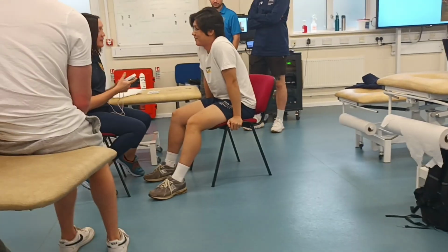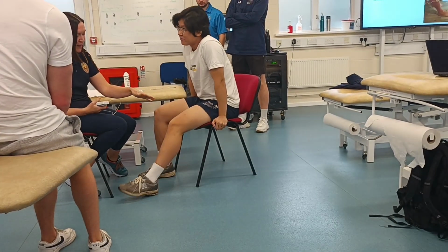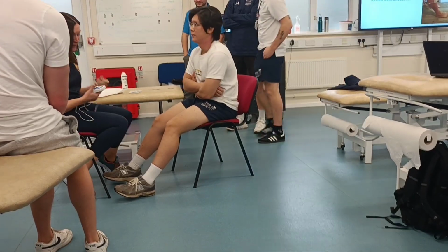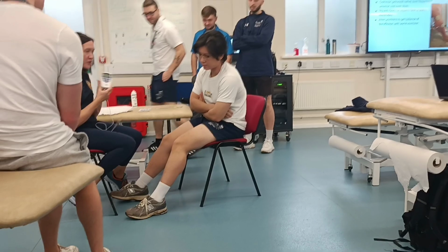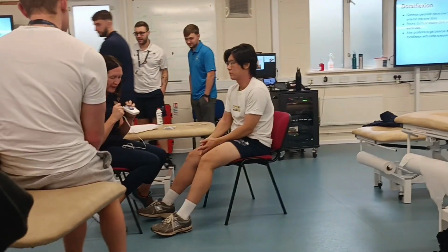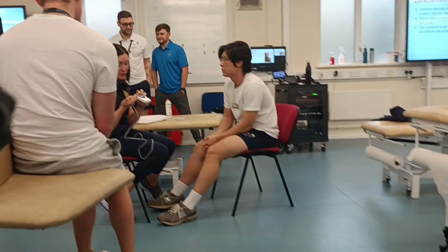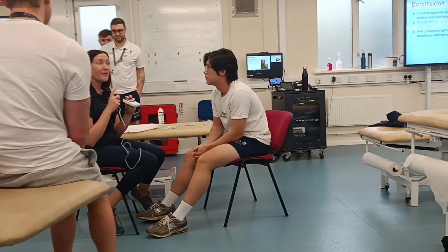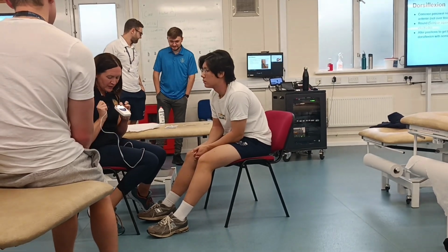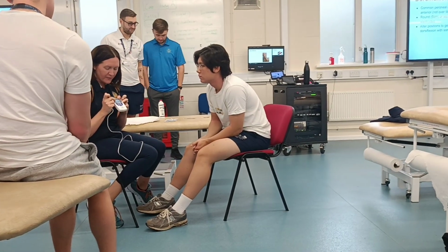Okay. So normally, if I was doing this with a patient, I would sit next to them, so you can see I shall come in front. Machines, you can't go too wrong with them really. We have got them all set up that they come straight onto program 15. I haven't actually checked them, but they should all be on program 15. So I'm going to turn it on, and I'm checking that it says P15.